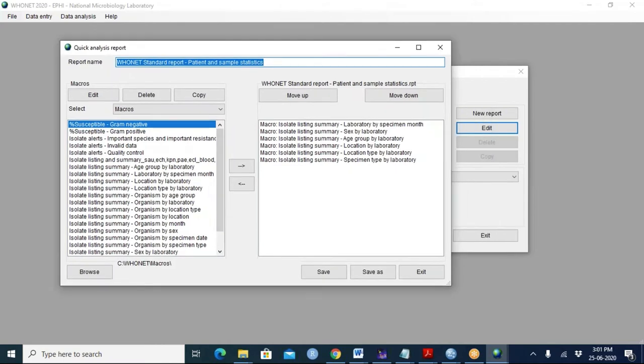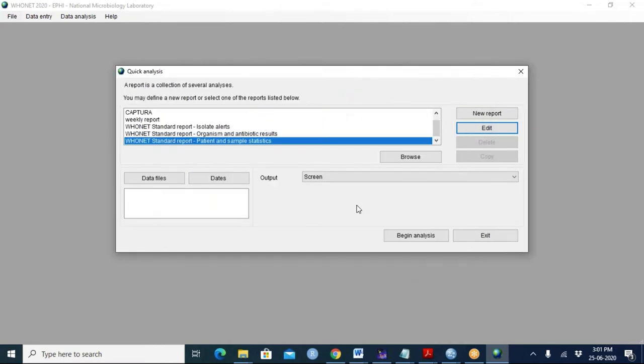May I ask one question regarding macros? Actually I understand clearly what you are discussing, so it's good. But my concern is, are macros case sensitive or not? For example, if you are writing big analysis. Excellent question. No, they are not case sensitive.